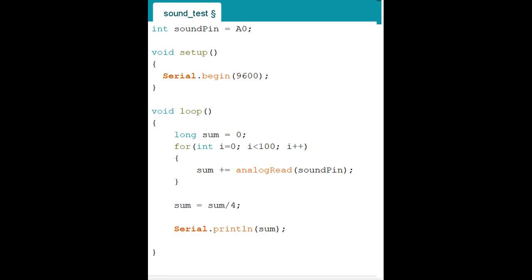So after you do that, press enter, and then we're going to write the second code, where a lot of things are happening, like execution is happening, calculation is happening, and things like that. So we're going to type void space loop, open parenthesis and close parenthesis. So loop is common. I think all languages use a loop. Loop means it goes over and over and over again, like looping, right? So this is a very powerful language, common in a way, because a lot of calculation requires the same execution.